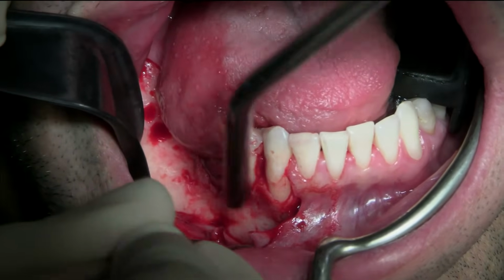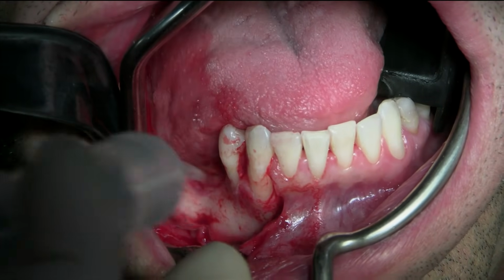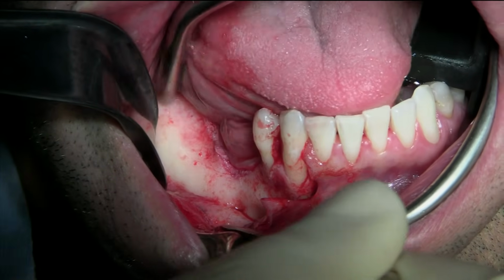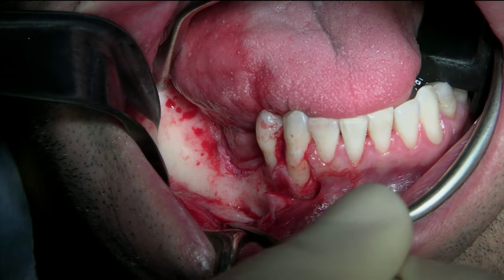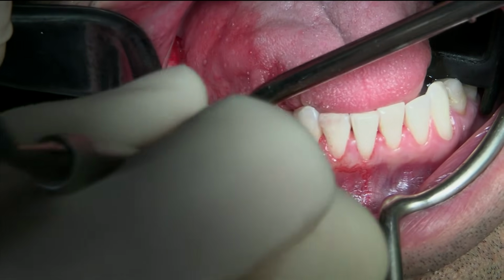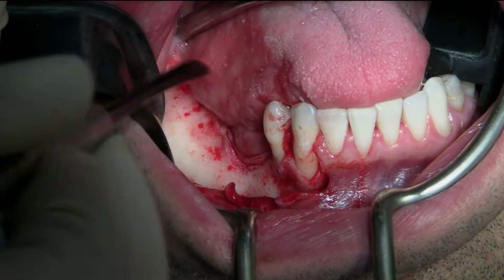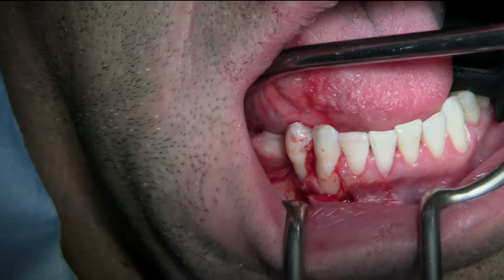Give me some irrigation. You can see the buccal flap now completely exposed and the mental foramen right there. You can see it. And now, of course, when we place the membrane, we're going to have to cut it in such a way that it's not going to get in contact with this, and we're going to move it in such a way that it will fit towards the lingual. So the whole buccal is exposed. We're good there. And let me see on the lingual.